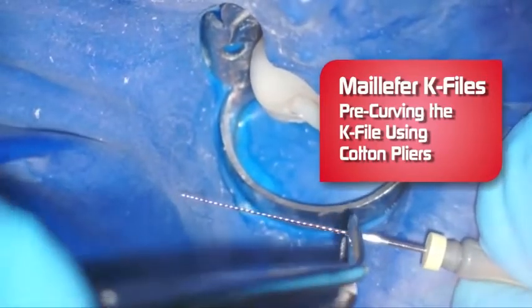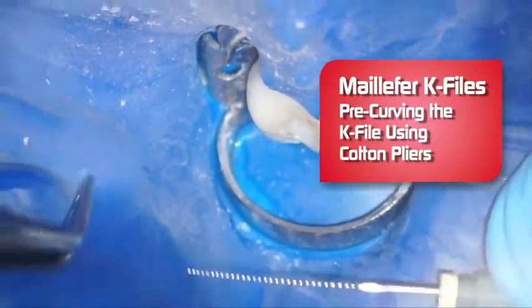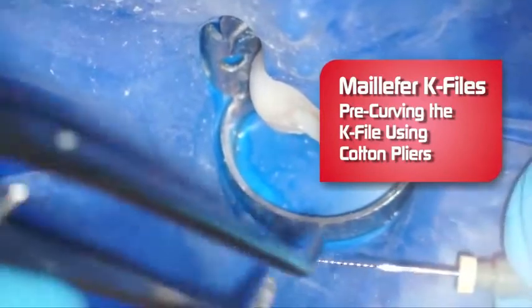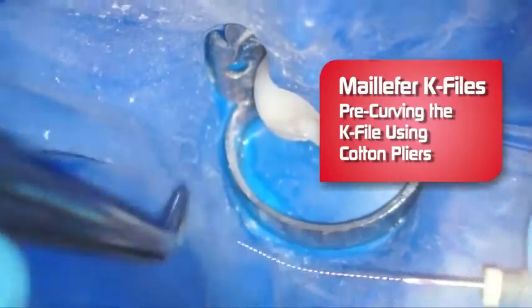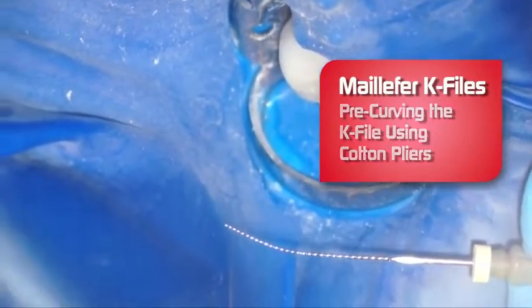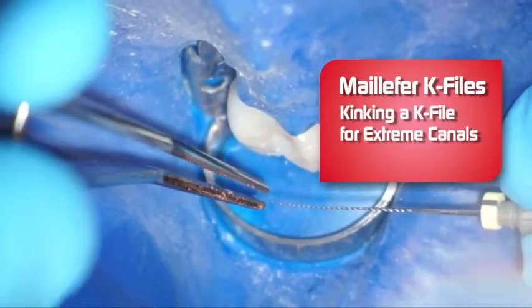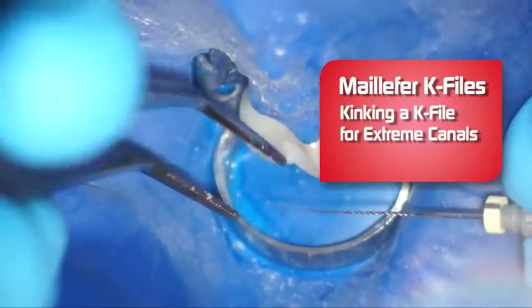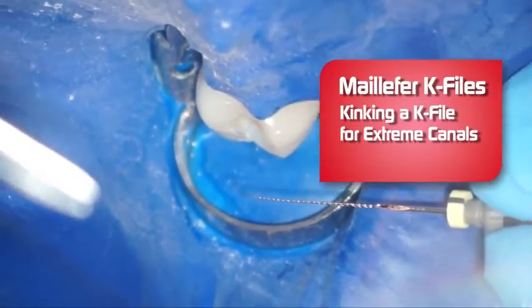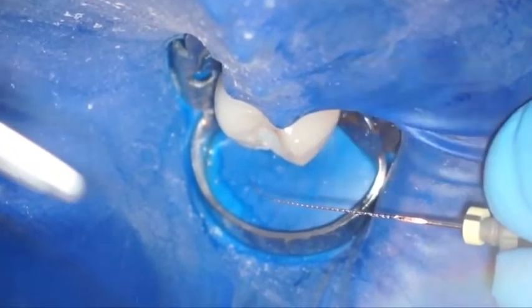I like to take some cotton pliers and just gently run them over the file without affecting the integrity of the file. You get a little curve there and it's easier to introduce into the canal. For an extremely dilacerated canal, I like to put a little kink in the end of the file, just like that, which allows you to negotiate a very dilacerated or MB2 canal with greater ease.